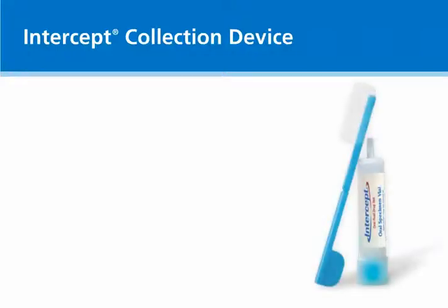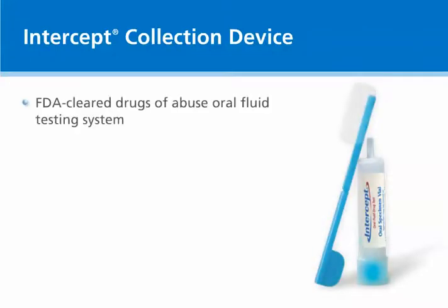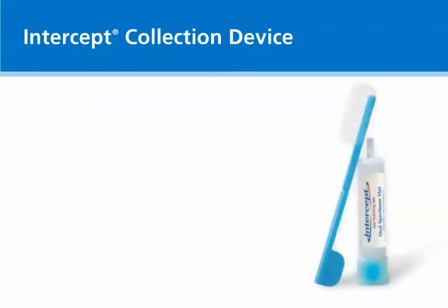The Intercept oral specimen collection device is part of an FDA-cleared drugs of abuse testing system. Once a proper collection is conducted, the sample is shipped to the laboratory for lab analysis and reporting. The collection device consists of two parts: the Intercept oral specimen collection pad and the Intercept oral specimen collection vial.